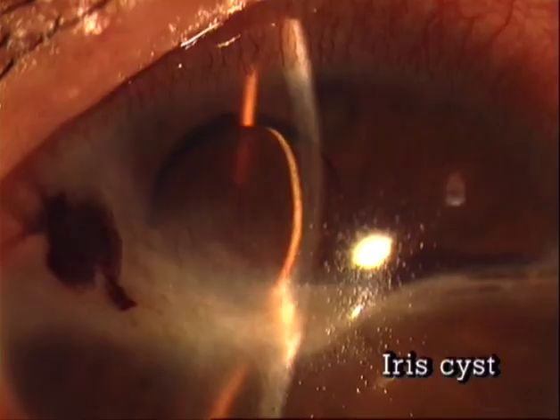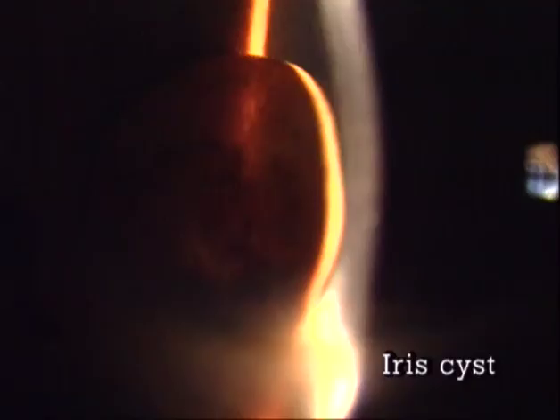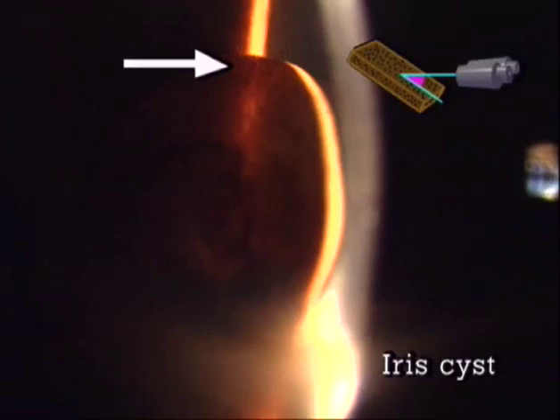This is shown here by the example of pigmented cysts in the anterior chamber. When seen through the front, the wall of the cyst is met nearly perpendicularly, and therefore one can see the bright slit light on its back side. When looked at through the summit, the wall of the cyst is met tangentially, and therefore it appears non-transparent and dark brown.